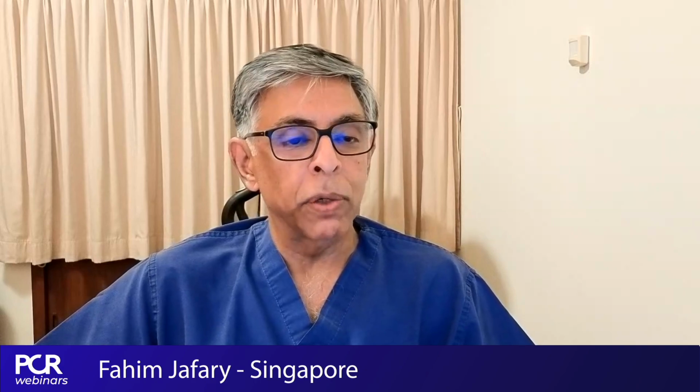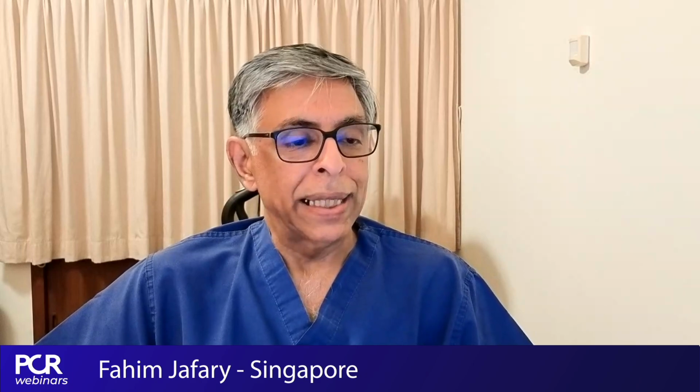You have to understand the pitfalls, and the biggest pitfall is that the result can be unpredictable. And so if you don't get a good enough balloon angioplasty result, you should be prepared to go with all the other options that the previous two excellent cases presented. So I think it's reasonable to go with the drug-coated balloon strategy, but with the option to change if the result isn't what you like.